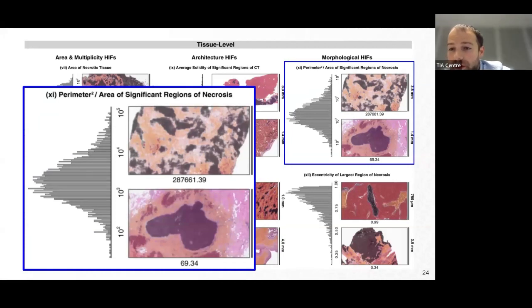With GradCam, so using your CNNs and using GradCam on them. Yeah, we did not play with other methods of obtaining the heat map. We relied just on the tissue and cell level models that were trained using the process described earlier. Brilliant, thank you. Great.